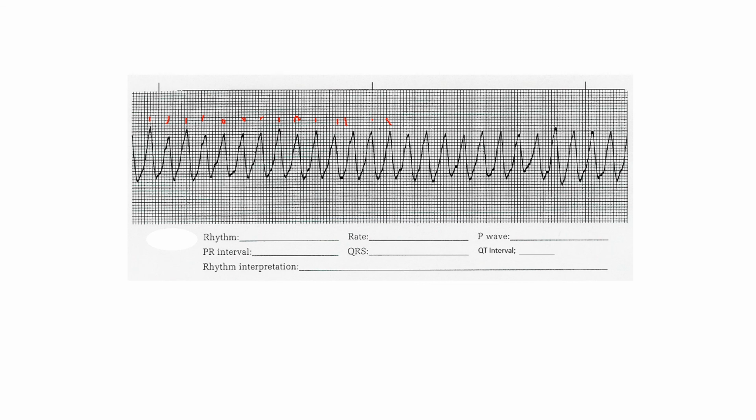It's very important to make sure that you sync with a pulse. You only sync with a pulse. This patient has a pulse. They have a blood pressure, so therefore they have a pulse. Even though their blood pressure is not great, they still have a pulse. So you always sync with a pulse.